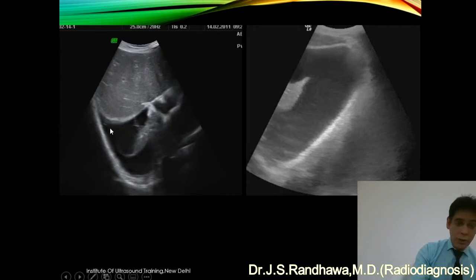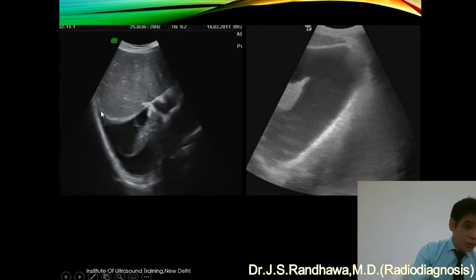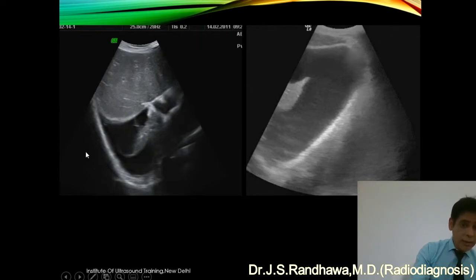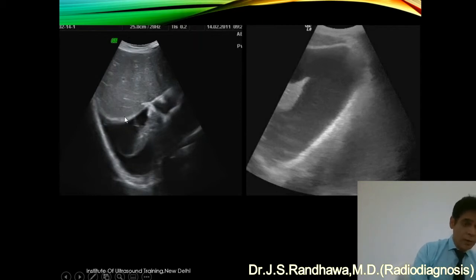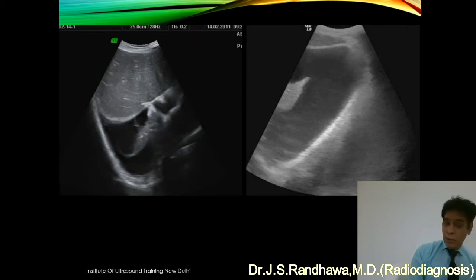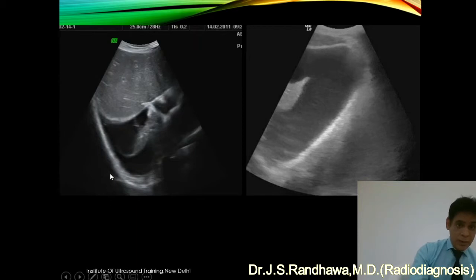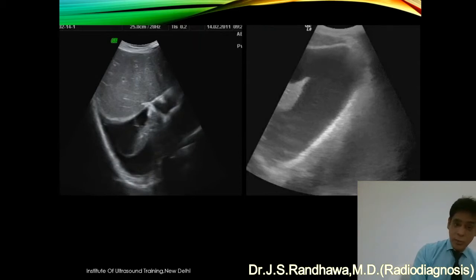Let us see the other points. In the transverse section, this fluid has an angle which is pointing toward the extreme right — this is the right side and this is the left side. In this picture again, this is a transverse section and here you can see the angle pointing to extreme left. The other thing you can make out is there is a thick bright area on both sides. The bright area here represents the diaphragm and the parietal layer of pleura in contact with the diaphragm, and here it is the visceral pleura. Fluid between the parietal and the visceral pleura is pleural effusion.